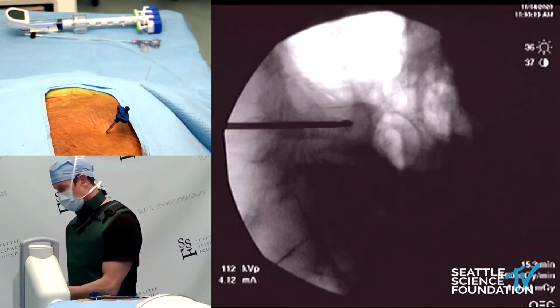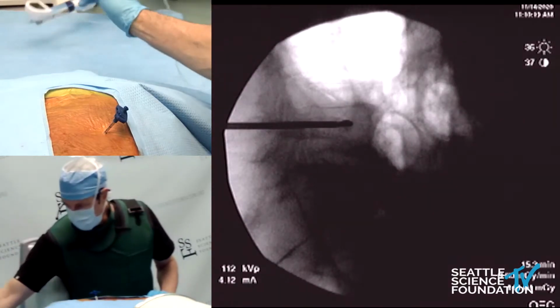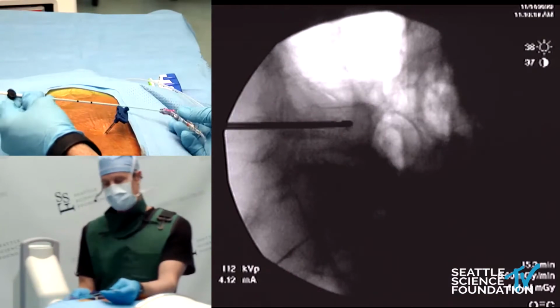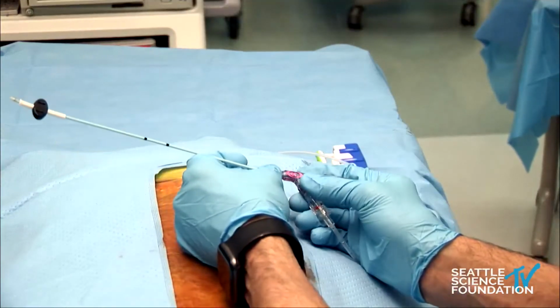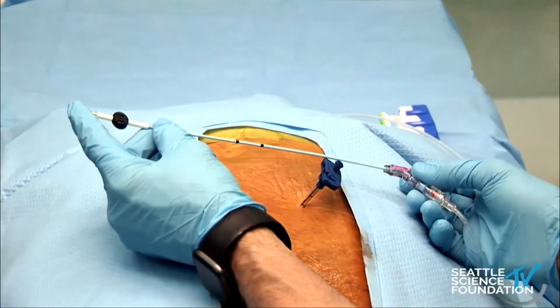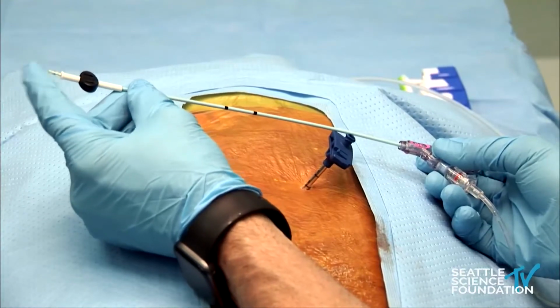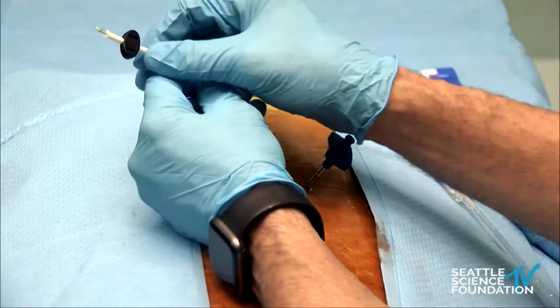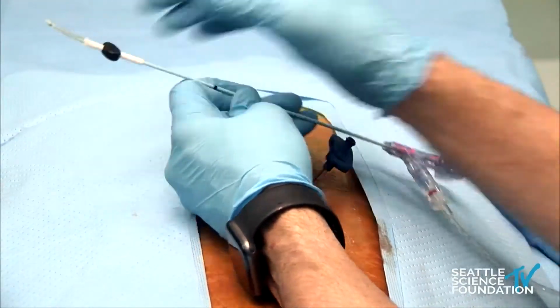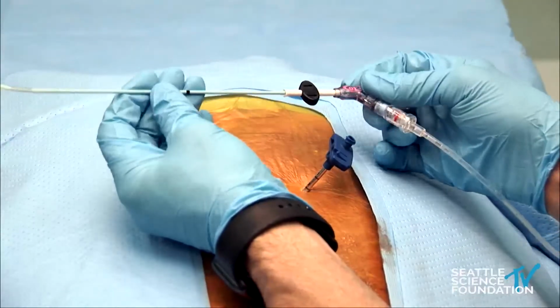And then the balloon itself is relatively new, having been released this year. And so the features on this would include an inserter, and this will lock back here, and after we deploy this, I'll pull it back to deploy it. This will allow recompression of the balloon. So once the balloon has been deployed, you can put this inserter on, and this will recompress everything, and after it's used, it's pushed up and locked in place, like so.